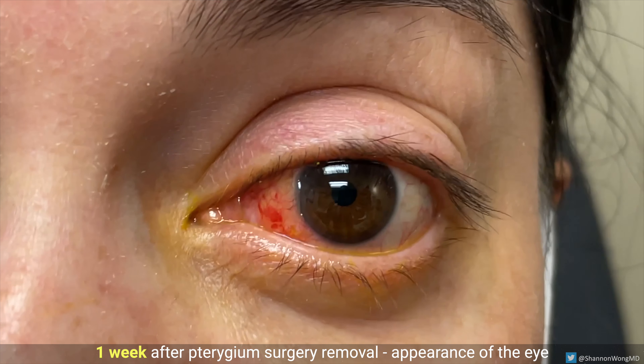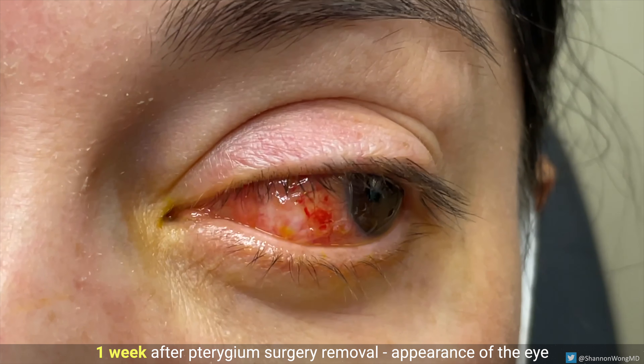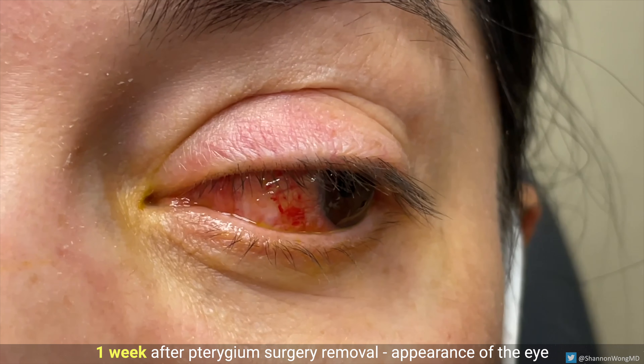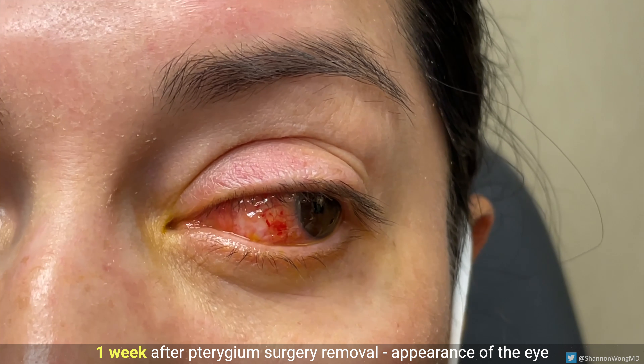One week later, the autograft has had time to fixate itself to the sclera and therefore the suture can now be removed. Most patients are very comfortable within two to three days after surgery.